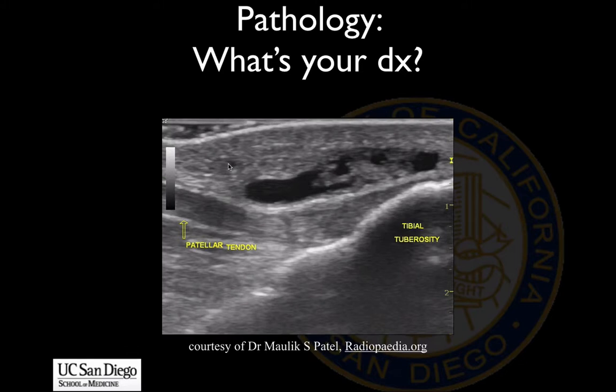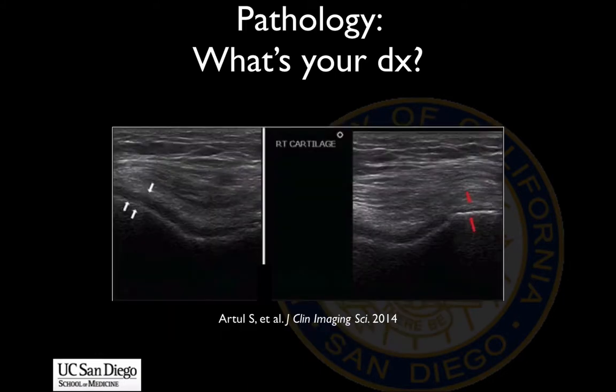In general, we don't see that much soft tissue swelling in this area because this is where the bursa lie. But here, because we have all of this swelling, this anechoic fluid with this echogenic material in this enclosed space, this is consistent with an infrapatellar bursitis. Again, normally the bursa are not well seen in the normal condition.